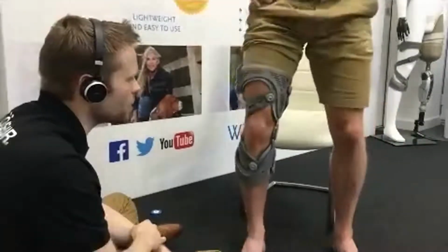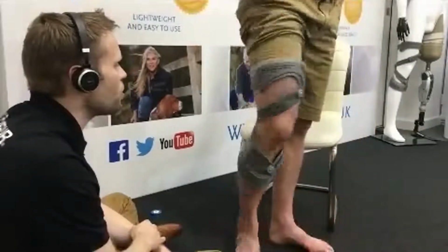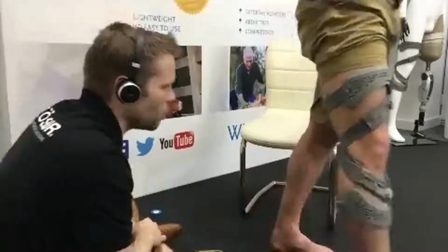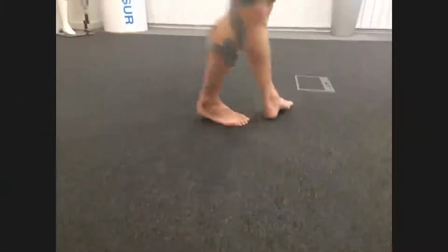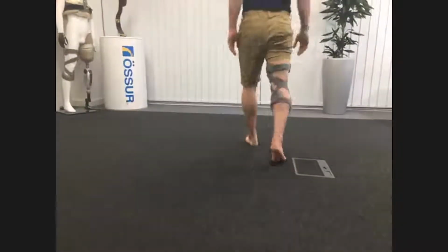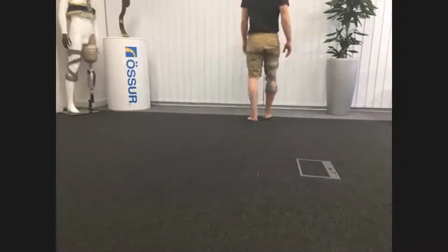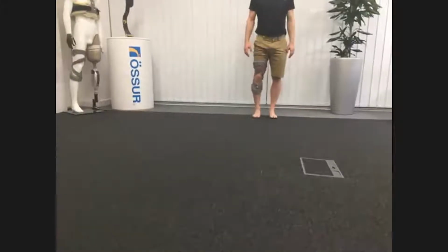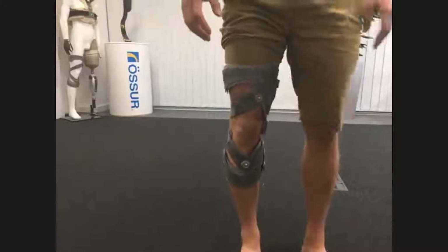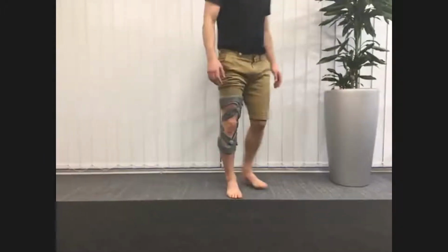We've got that in position, and what we're going to do now is just go over to the mobile camera and have a look at Pete having a walk. Okay, so with this, you can see that as Pete actually walks, we've got the changing of tension in those straps. So when he flexes, the tension reduces in those dynamic force straps, and it's in line with where the position is of the osteoarthritis within the knee.